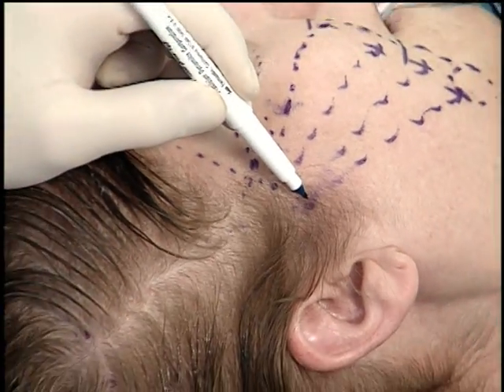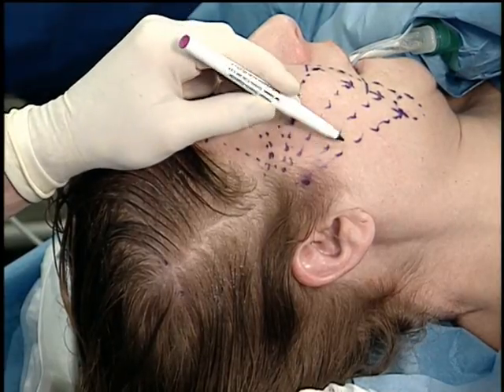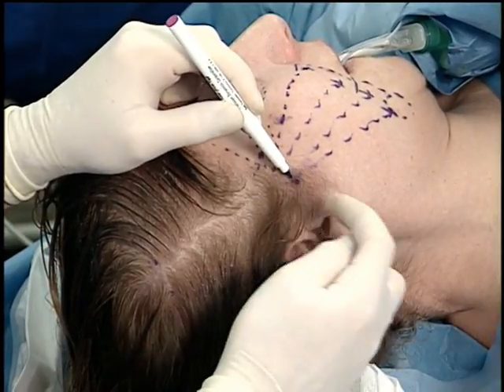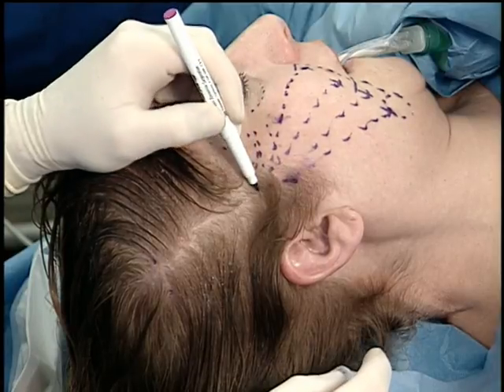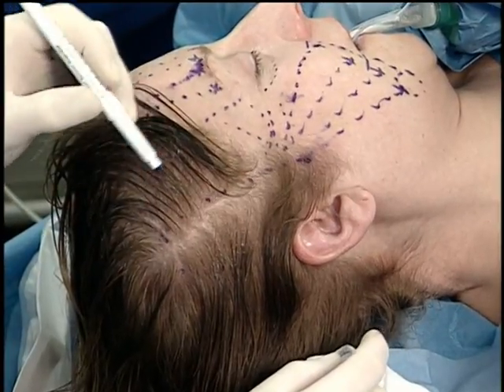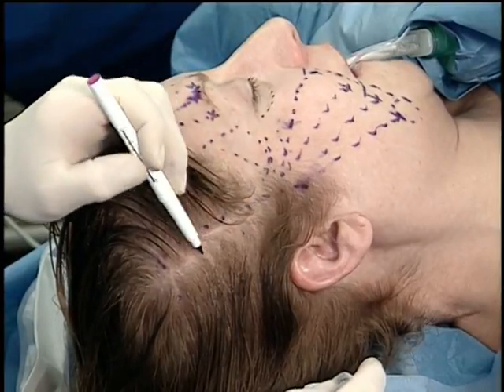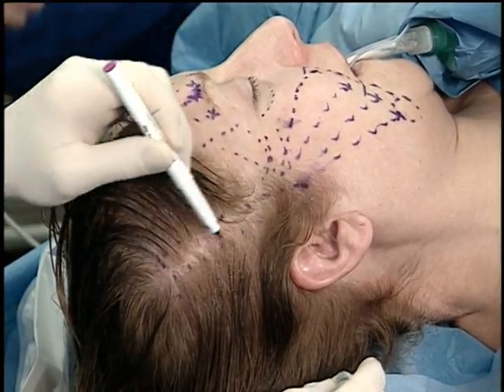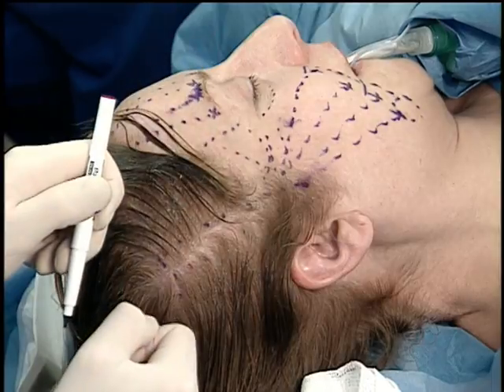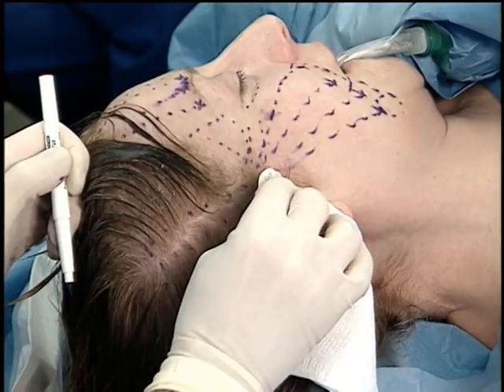We're going to use this common point right here to act as an N, or right side up, N-shaped loop lift. And we're going to use this point for a U-loop lift. So we're going to deploy our articulus thread superiorly here and bring one arm north to exit in our pre-marked spot in the temporal parietal area, and the other arm coming north and exiting about 2 inches away. Then we create a nice U in the scalp, and that U will be used to harvest and lift that face under tremendous amount of tension.